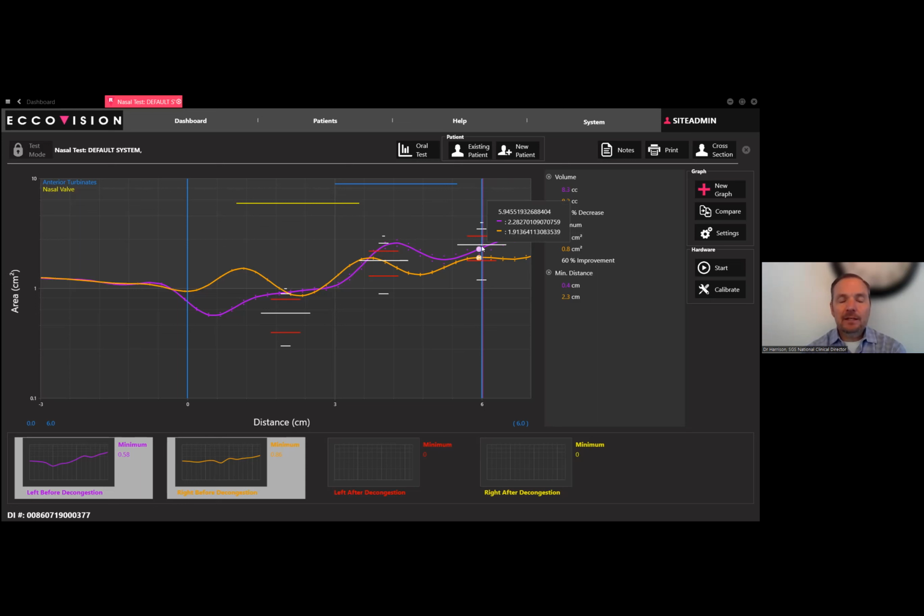Also, I think I had another thought here, and now it's kind of escaped my mind, but it'll come back to me when we move on, I'm sure. But rhinometry, oh, I got it. I love it. This is getting older, stinks, man.